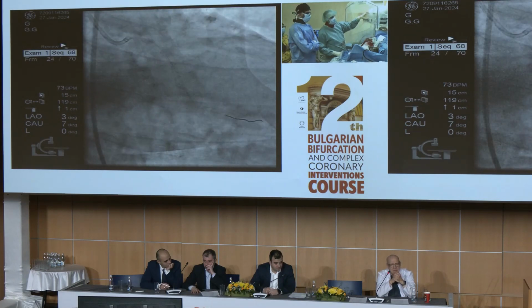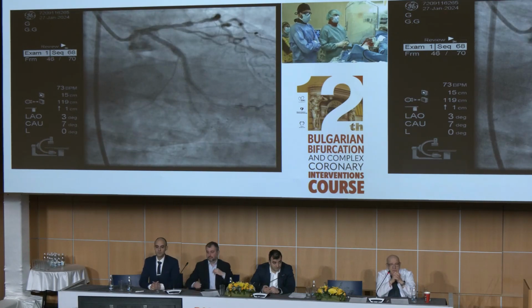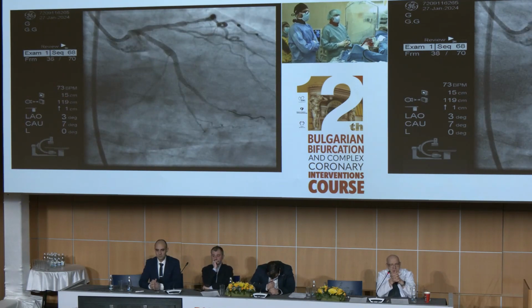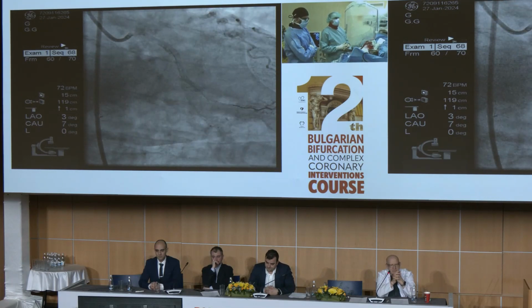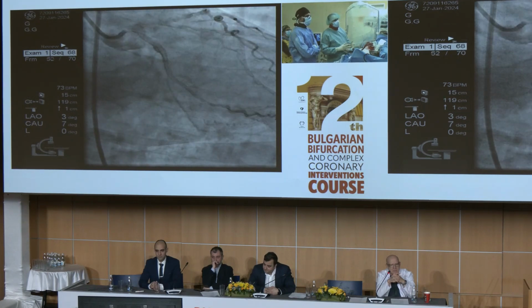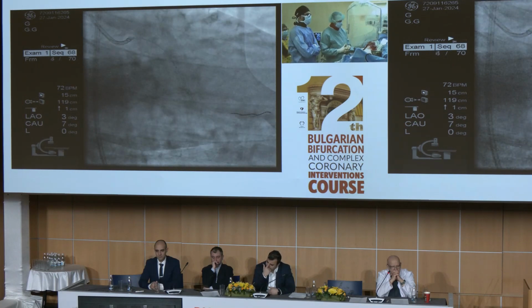There is no evidence that the patient will be better. In fact, we have evidence that graft stents, even with the drug-eluting stents and drug-coated balloons, are associated with a quite high number of restenosis and reocclusions. Actually, sometimes nature helps us, and the restenotic process just resolves these problems.